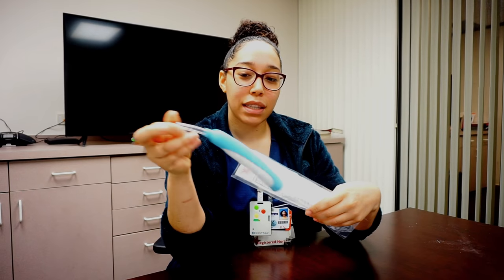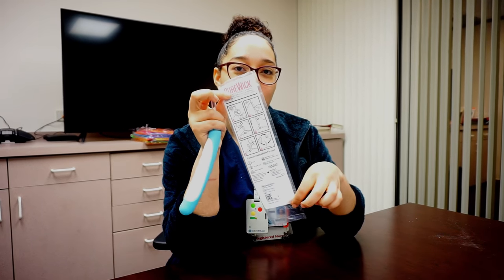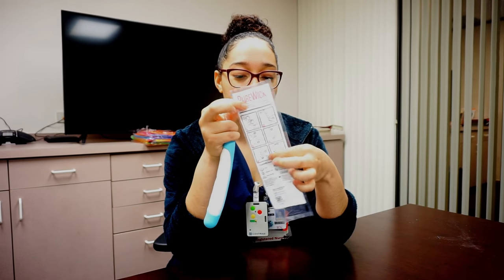This is the Purewick. It has instructions on the outside on how to use it. They're step-by-step so they're really easy to follow.